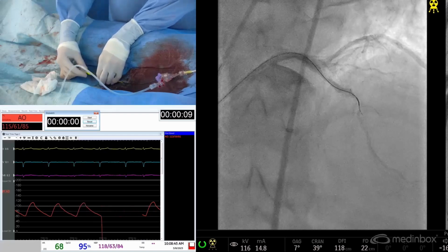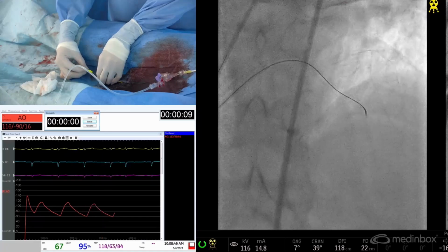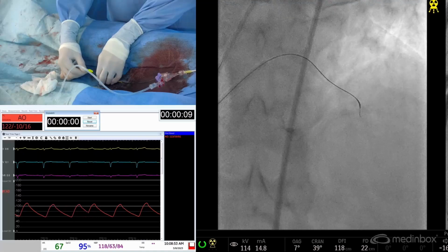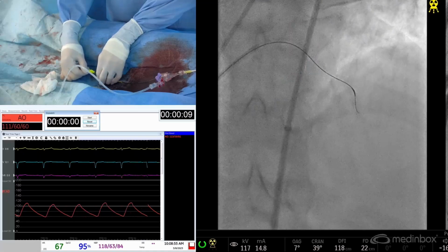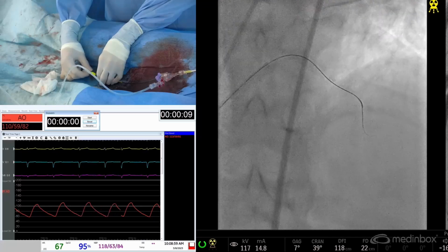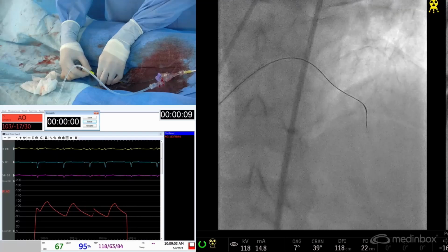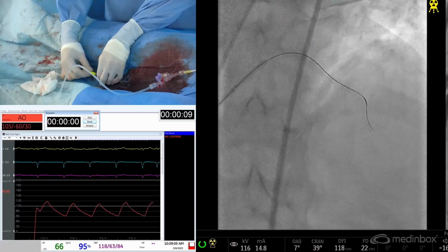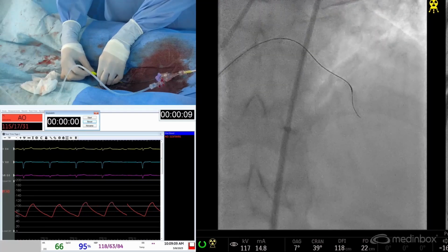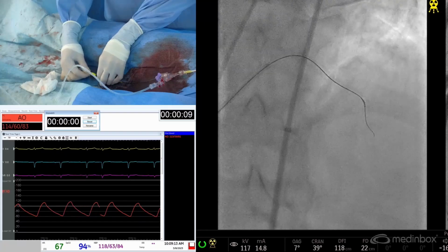Our initial plan was to do orbital atherectomy of the lesion due to the size of the vessel. Obviously, the lesion is subtotal, so no intravascular imaging would have been possible in this lesion preemptively. However, just by repeating the angiogram today, like Dr. Lee mentioned, we found that the lesion has restenosed, and we don't think the lesion caliber would allow the passage of the orbital atherectomy.